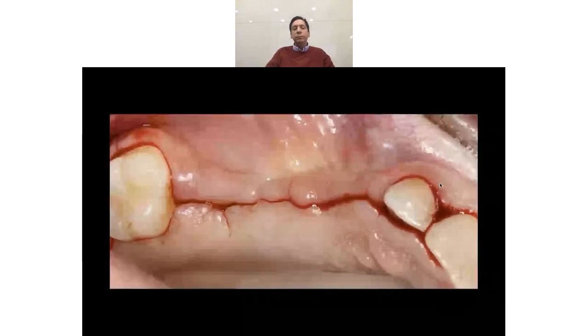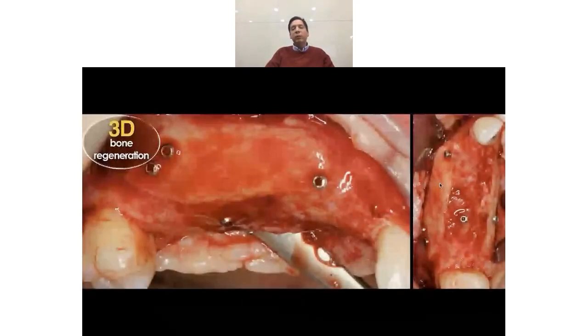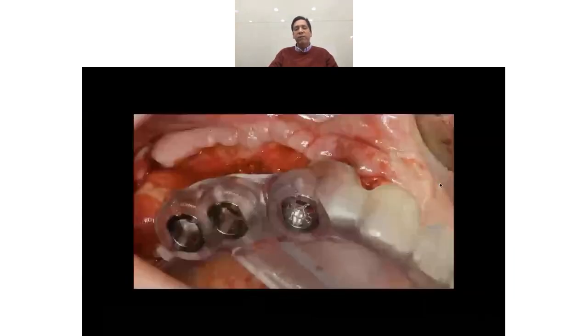And here, we can see the incision. And this is the aspect of the bone when we raise the flap. We can see a vital, bleeding, mature bone. See the palatal cortical block, the buccal cortical block is totally vital, bleeding.